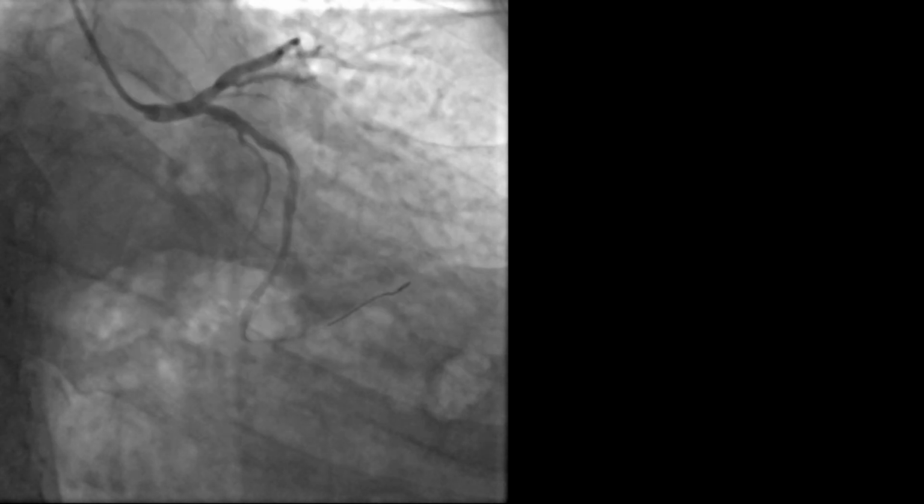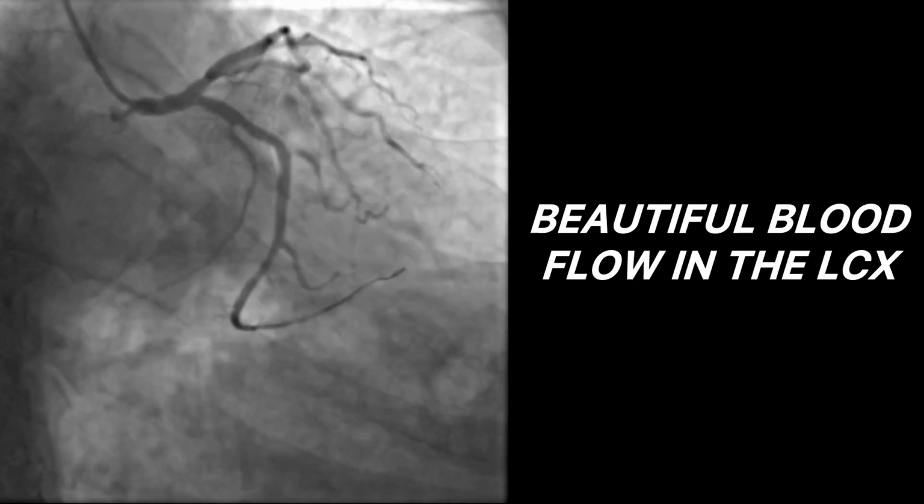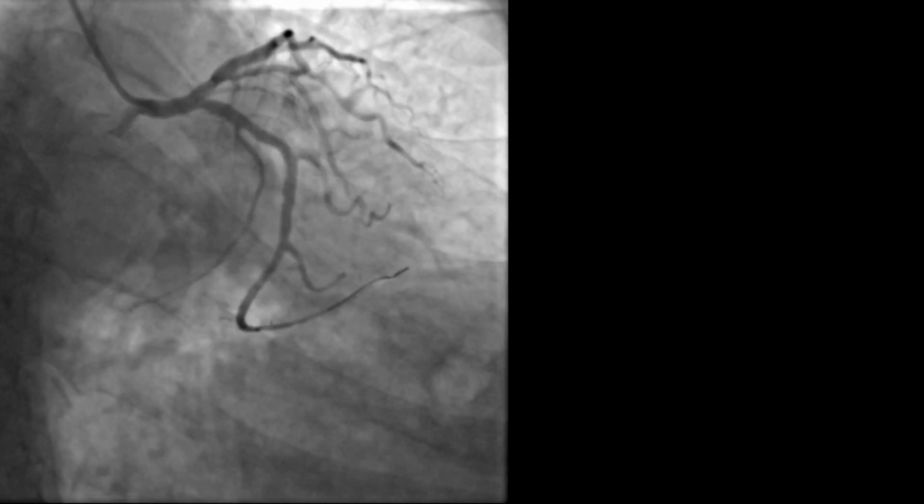We inflate the stent and there it is. Look at the result. Blood flow is fully restored in the previously occluded vessel.